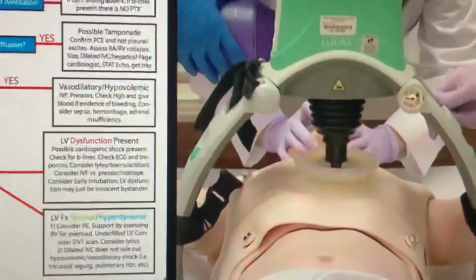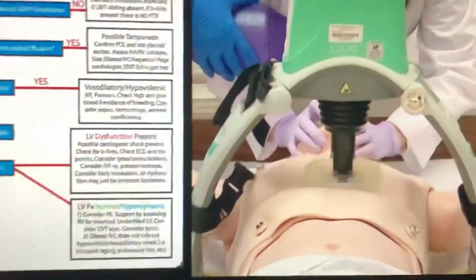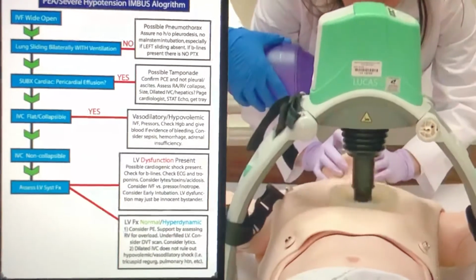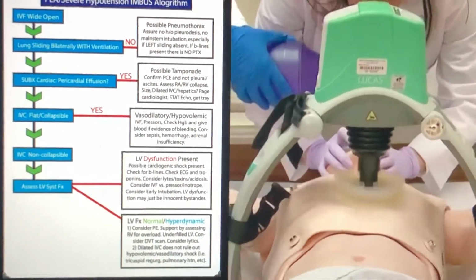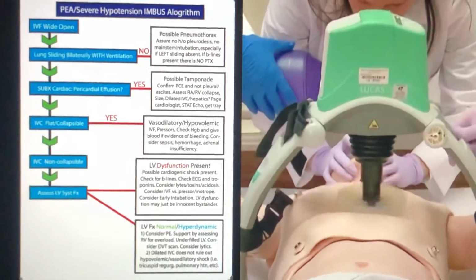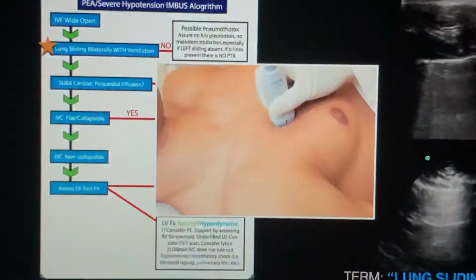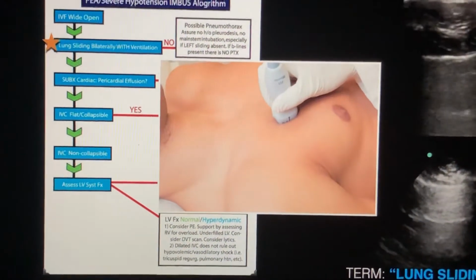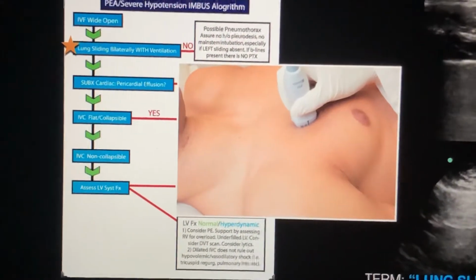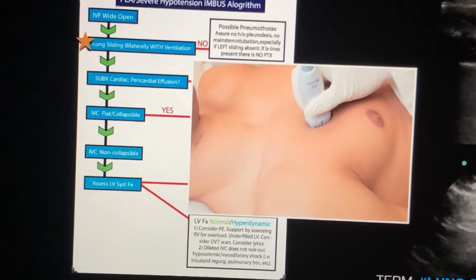The pure mechanics of ultrasound image acquisition can be really difficult amongst a crowded bedside with compressions underway. However, when the team's adequately trained, quick ultrasound integration into a code is feasible both during compressions and at pulse checks without a significant delay in compressions. While there's no specific order that has to be followed for code ultrasound, there are a bunch of different protocols that exist in the literature and in practice. There is usually a logical progression that frequently makes the most sense in the arresting patient.